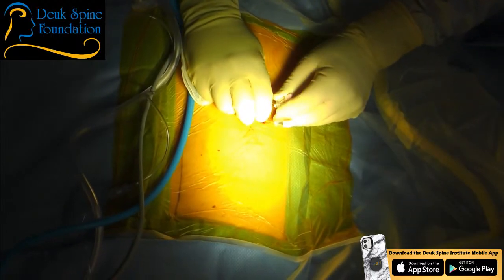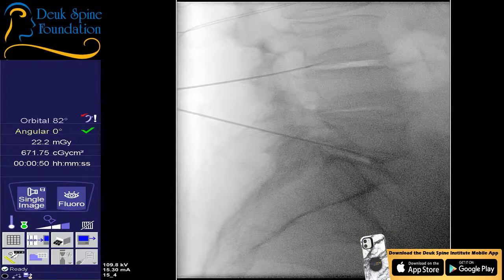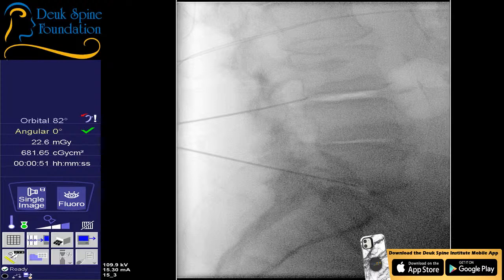This side is so collapsed. Yeah, keeps getting deflected. Question is why? What am I not seeing? Let's wag it a little bit. It must be missing something on the bottom pedicle. It must be the scoliosis between these two levels. Let's see if we can bring the pedicle down. Yeah, a little more of that.